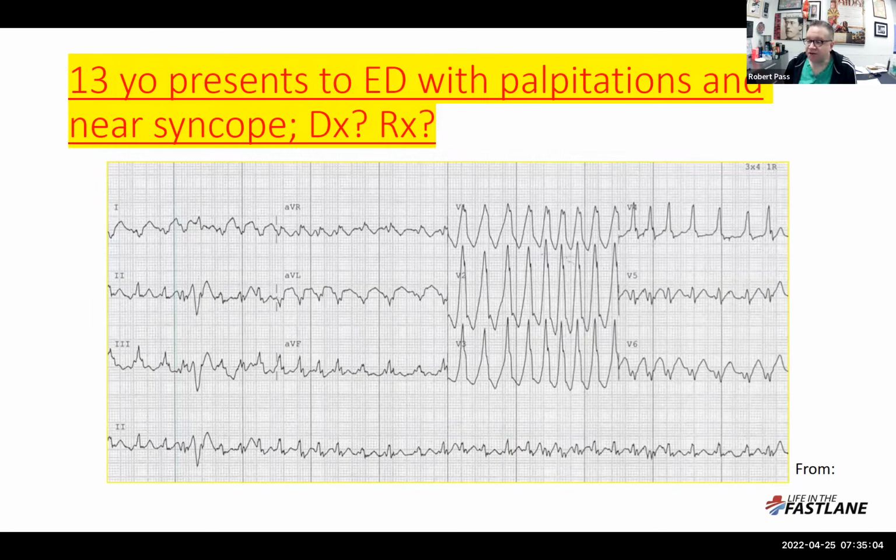So never, ever, ever touch a patient for a synchronized cardioversion until after the shock has been delivered. Sometimes you press it and you wonder why it isn't shocking. It could sometimes go on for 5 or 10 seconds. One of the biggest mistakes you could make is to go touch the patient or see if the pads are not touching the patient, because that's exactly when the device is going to go off. So if you press the button and it doesn't deliver a shock and you're not sure why, and it's been a long time, turn the machine off. Then you can figure out what's going on, or turn off the defibrillation part of the defibrillator. Then it's safe to check.